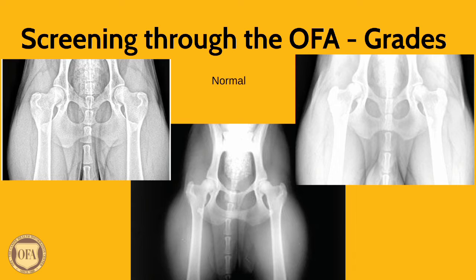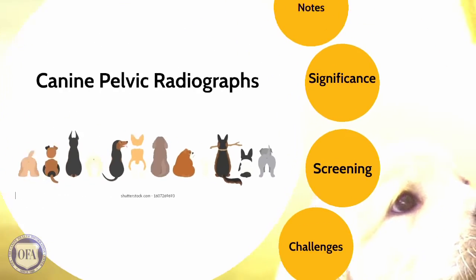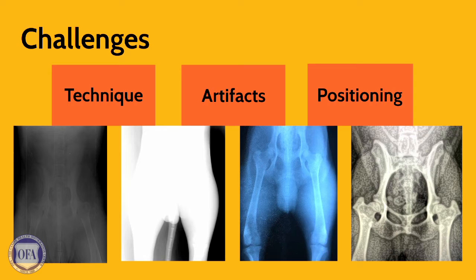Grading of hips is categorized into normal, which ranges from excellent, good, or fair, borderline, in which no consensus is reached and resubmission is recommended, or dysplastic, ranging from mild, moderate, to severe. This is based on conformation and evidence of any subluxation or hip laxity or degenerative changes. Within 2021, over 46,000 dogs had evaluations for hip dysplasia.